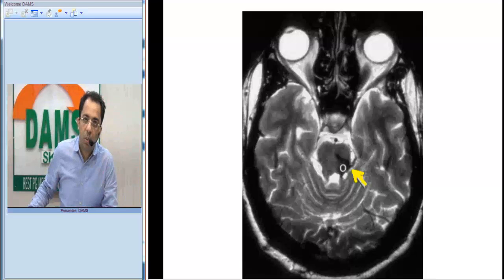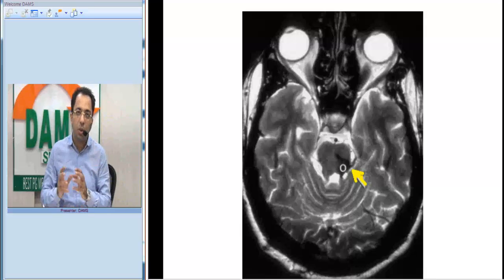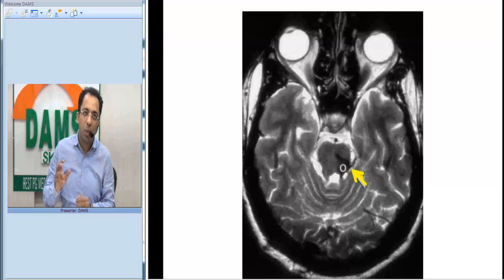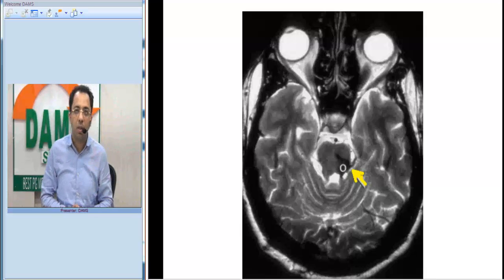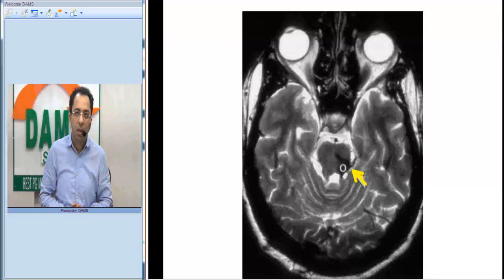On this T2 weighted image you can see a hypointense area in the dorsal part of the pons on the left side. On the dorsal pons you have a hypointense area. This could indicate hemosiderin staining in this area, or old blood products.